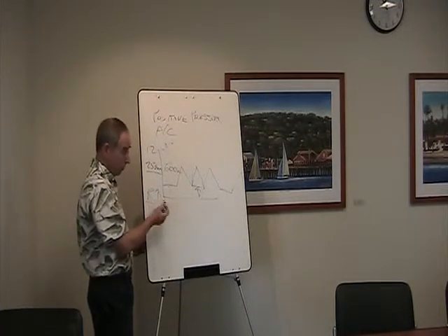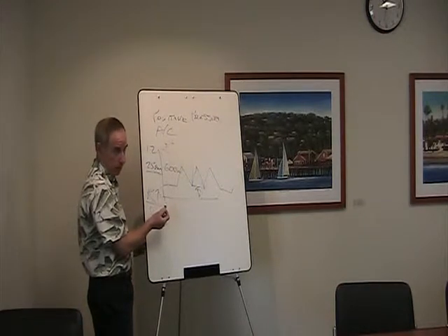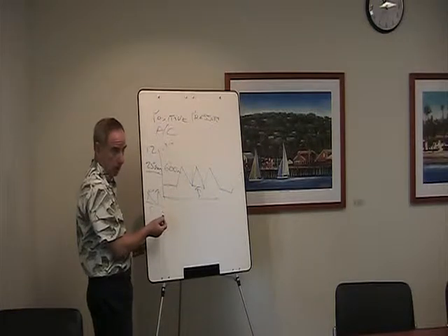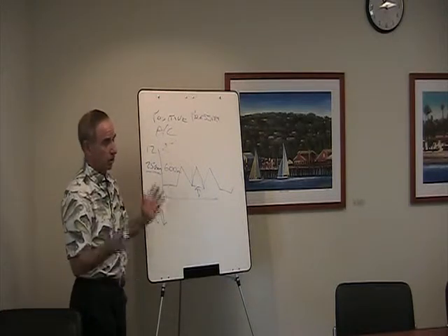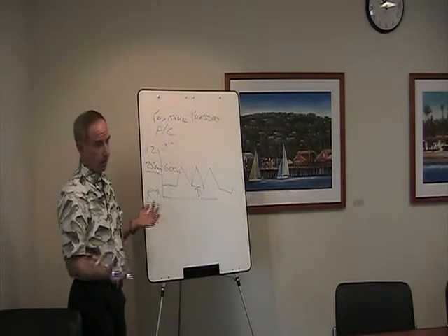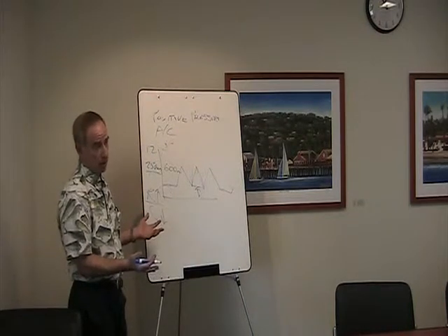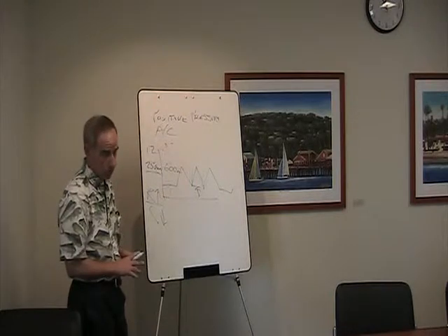Conversely, if for some reason you have an improvement in resistance, what's going to happen to your volume? It's going to go up. And if you have an increase in compliance, it's also going to go up. Okay, so just always start trying to think in those terms when you're thinking about ventilation. What's the effect of resistance and compliance on this mode of ventilation or this particular case? So what sort of conditions increase airways resistance?